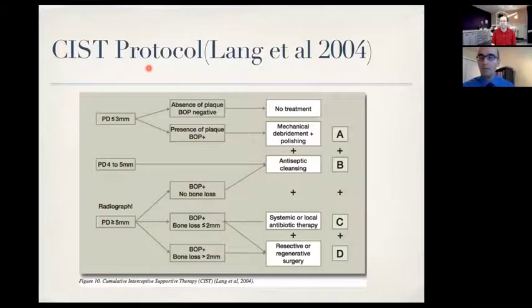My point is we should not be afraid of touching implants, because in general practice, those practitioners that refer patients for implant surgery or crowns, or the hygienists, may be afraid of touching implants because they may think they could destroy the implant by doing proper maintenance and cleaning. My suggestion is, as long as we use the proper instruments that we should have in our practice, we should not be shy of going around the implants and dealing with the problem at the very earliest stage. But clearly you have to have the right instruments and know how to use them. Exactly. That's very important.